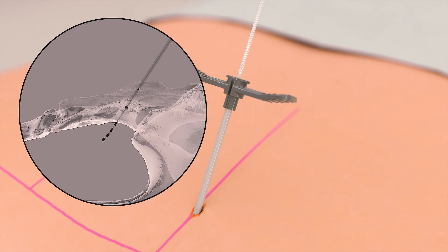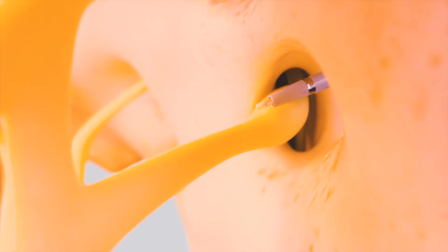To readjust the angle, the lead is retracted back into the sheath to the first white marker such that the electrodes are housed within the sheath. The lead is gently twisted to a slight degree, allowing for a slight change in the angle to obtain the ideal trajectory. The tined lead should be positioned with a slight curvature from cephalad to caudad following the path of the nerve.